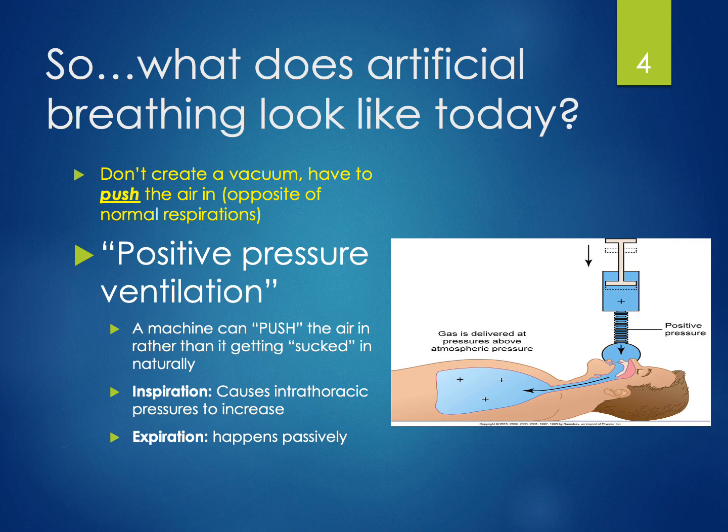So because we don't use the iron lung anymore, which mimics that negative pressure ventilation, we actually use positive pressure ventilation to breathe for our patients or mechanically ventilate them. So rather than our patients sucking air in, we're pushing that air in with a machine. So therefore, while normal physiological inhalation should cause negative pressure and decreased intrathoracic pressure, inhalation with a mechanical ventilator actually causes an increase in intrathoracic pressure. Now that's inhalation. So what about exhalation?